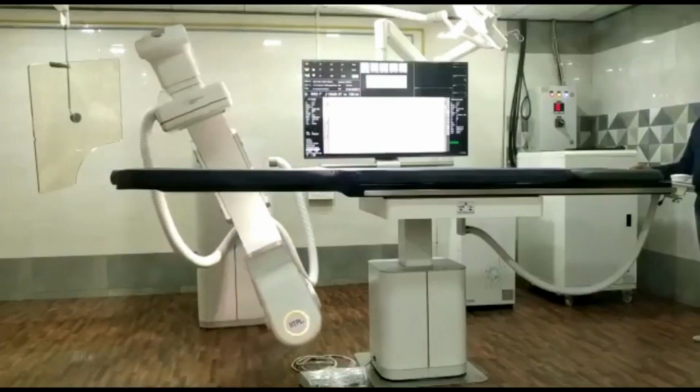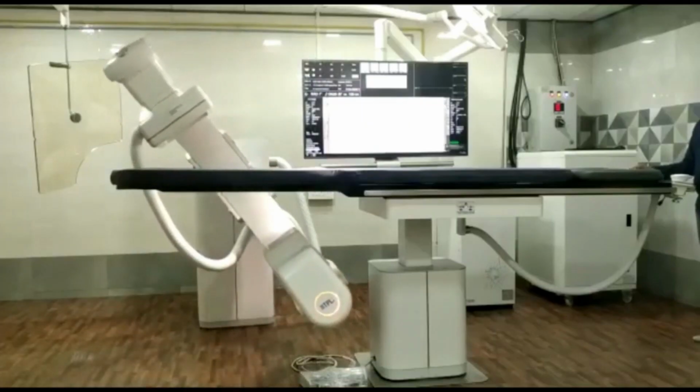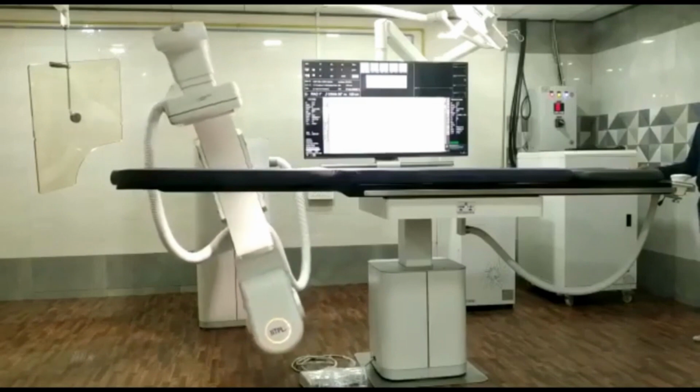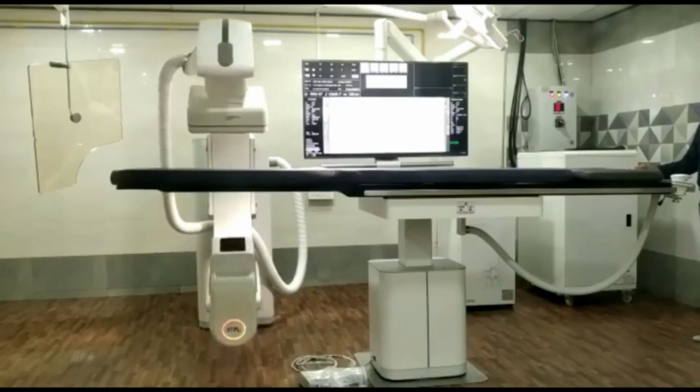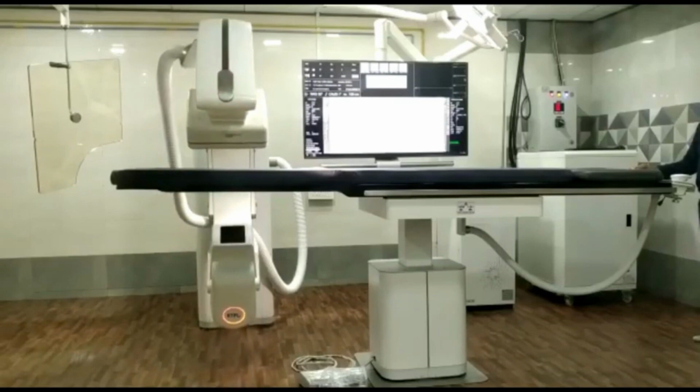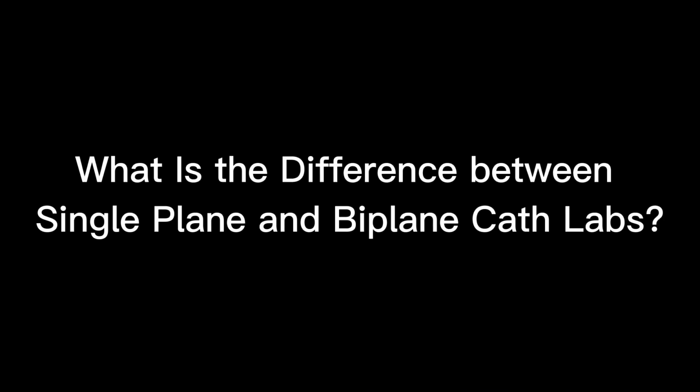What is a cath lab? It's short for catheterization laboratory. It is an examination room in a hospital or clinic with diagnostic imaging equipment, where physicians perform minimally invasive tests and procedures to diagnose and treat, for example, cardiovascular diseases.